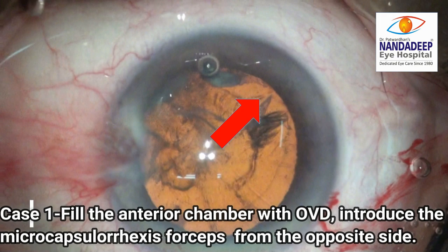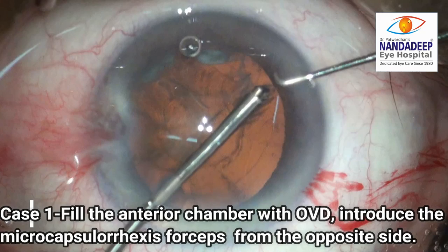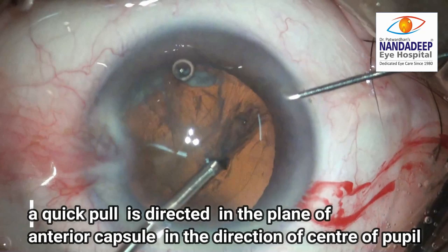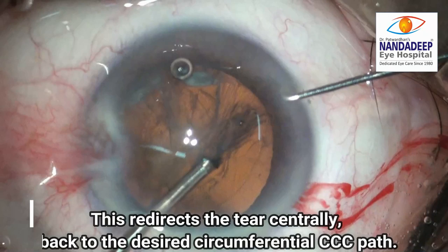In the first case, the CCC has already extended to the zonules. We fill the chamber with a viscoelastic and introduce the microcapsulorhexis forceps from the opposite end, for the optimal angle of approach to apply traction. After holding the flap, a quick pull is given to the capsule directed to the center of the pupil. This movement forces the capsulorhexis back to a continuous curvilinear shape. Again showing the movement in slow motion for better understanding.